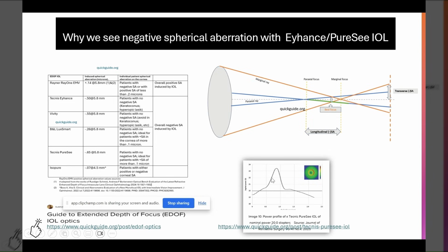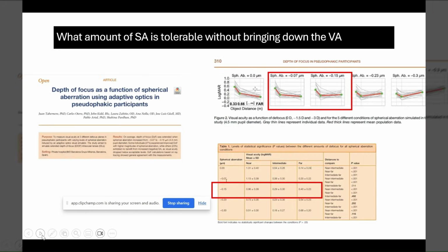So remember, this is on the IOL plane. On the corneal plane, the effective power will be much less. Some studies say that the effective power could be around 1.75 diopters of depth of focus for patients at 0.2 logMAR. All right, so that's how.